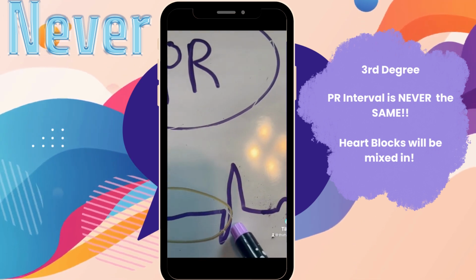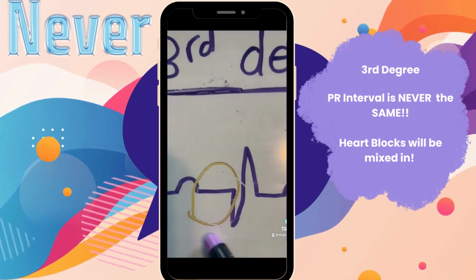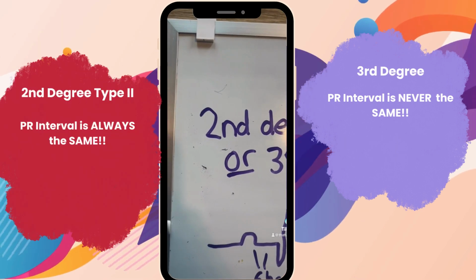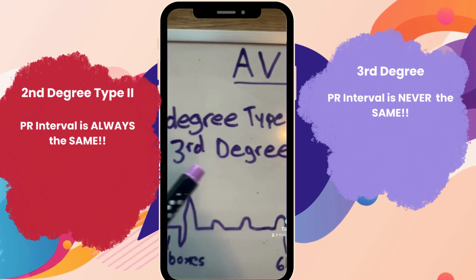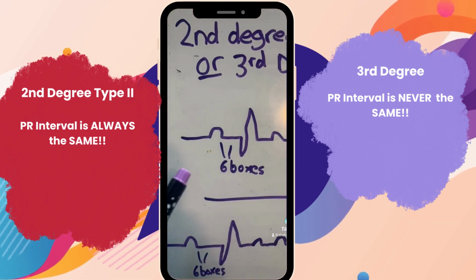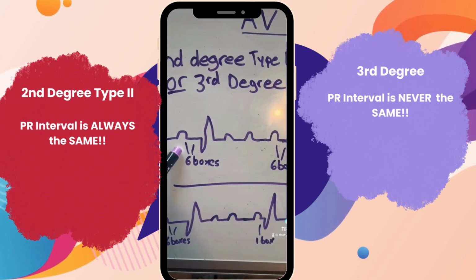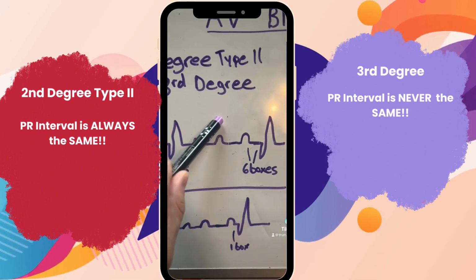So when you're trying to decide if it's second degree type 2 versus third degree, just know, look only at the PR interval, and you're going to find out really quickly just by looking at the PR interval by itself. So one of the biggest challenges people have with heart blocks is just knowing the difference between second degree type 2 or if it's a third degree heart block. So here is an example of how we can quickly identify it. We have one example here that has heart blocks, but the PR interval on the first one is 6 boxes.